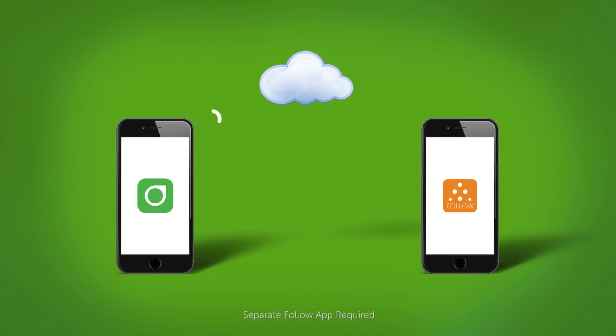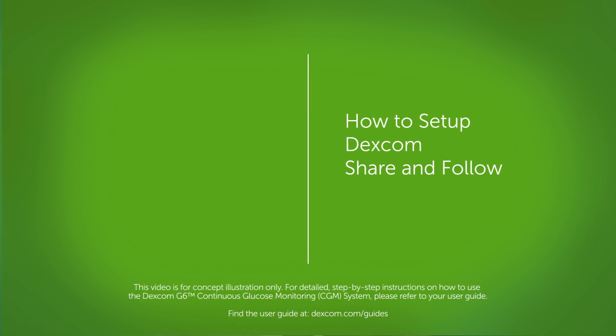Dexcom Share is a feature of the Dexcom G6 app. With Share, you can send your data to up to five followers. This is how it works: your Dexcom G6 app sends your glucose information to the cloud via Wi-Fi or your mobile connection, then the cloud sends your Dexcom information to your followers. In this video, I'm going to show you how to set up Dexcom Share and how your followers will set up the Dexcom Follow app.